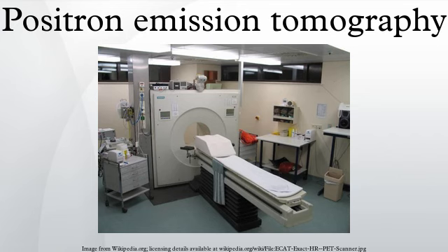Cardiology: atherosclerosis and vascular disease study. In clinical cardiology, FDG-PET can identify so-called hibernating myocardium, but its cost-effectiveness in this role versus SPECT is unclear. FDG-PET imaging of atherosclerosis to detect patients at risk of stroke is also feasible and can help test the efficacy of novel anti-atherosclerosis therapies.